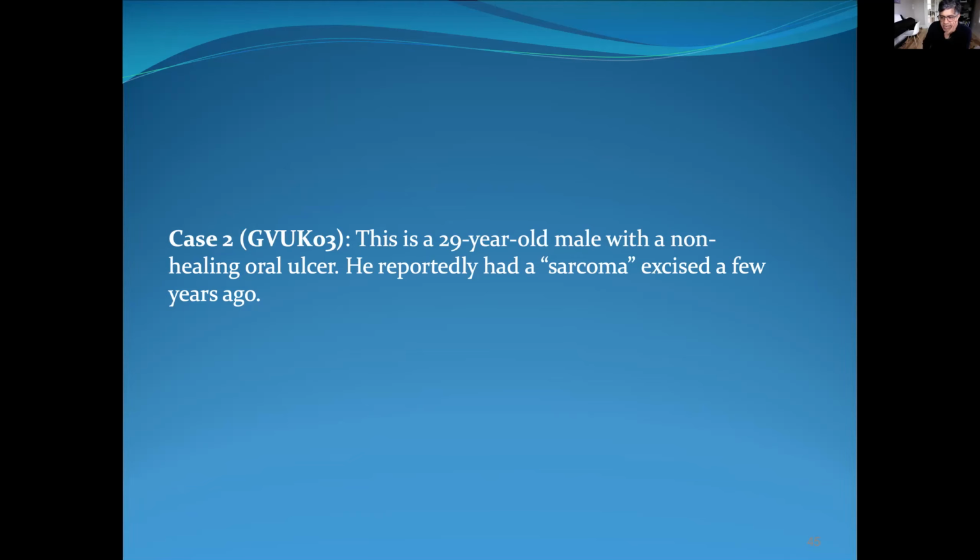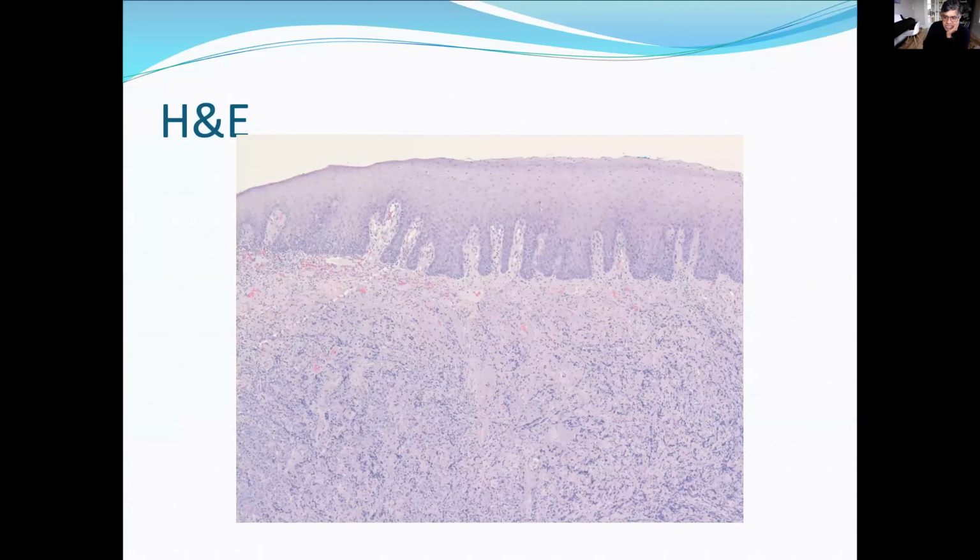So with that said, I will go on to show you what the biopsy showed. This is what came to me earlier. This is the H&E showing a squamous epithelium right there, and there seems to be some infiltrate in the subepithelium.